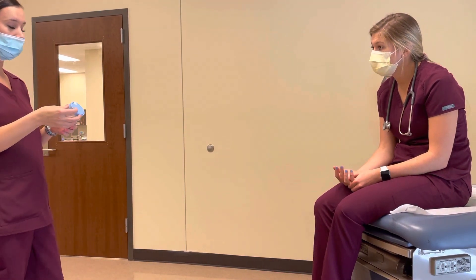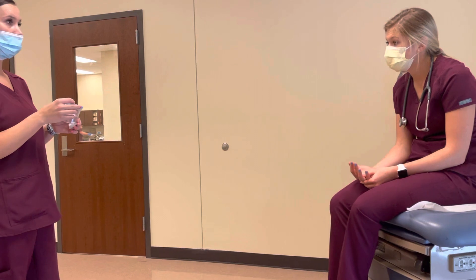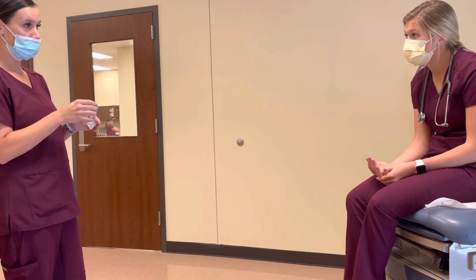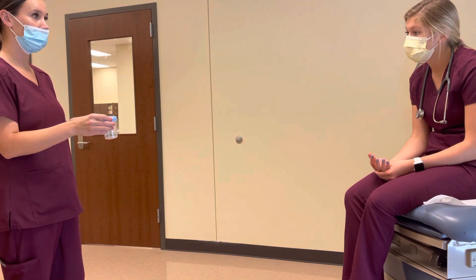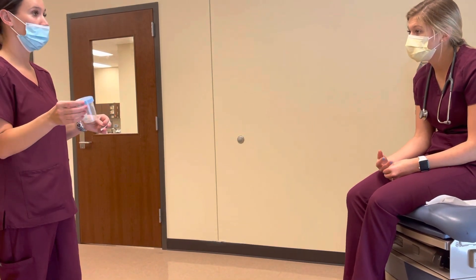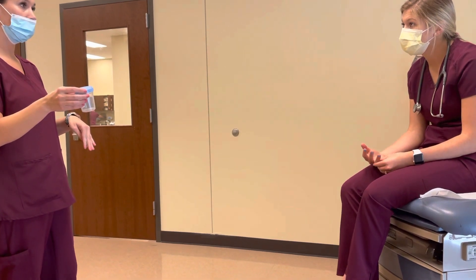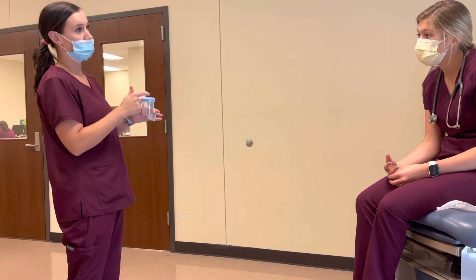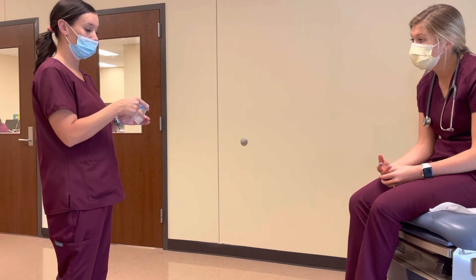And then what you're going to do is you're going to start to void in the toilet. And right after you start that, stop and start peeing in the cup. You only need it about halfway full. And then after that, you can move the cup and finish peeing in the toilet. Just make sure you don't touch the inside of the container or the inside of the lid so you don't contaminate it.